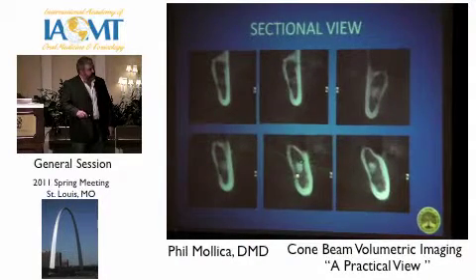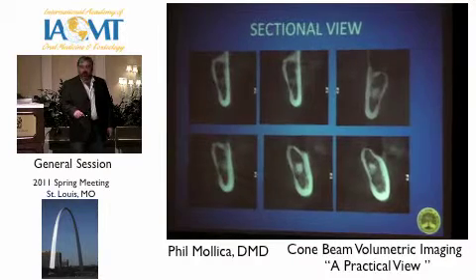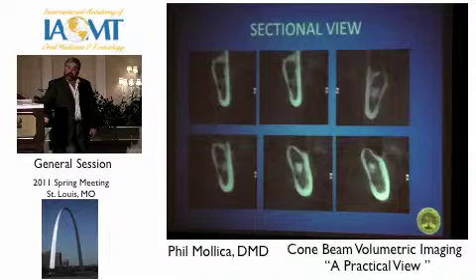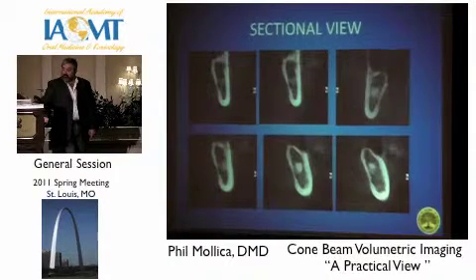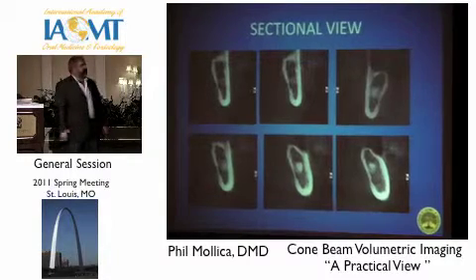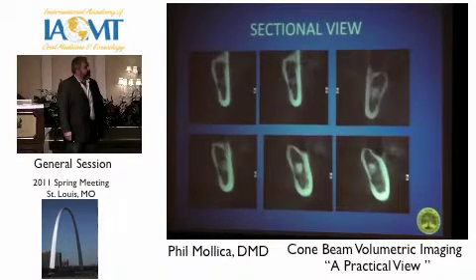We can see the root tip sitting in these areas. And it's funny, going through these cones where there were extractions done, it's amazing how many little root tips were left behind at one time. Okay? We find that all the time up there. Whether we go fishing or not, that remains to be seen. Okay?